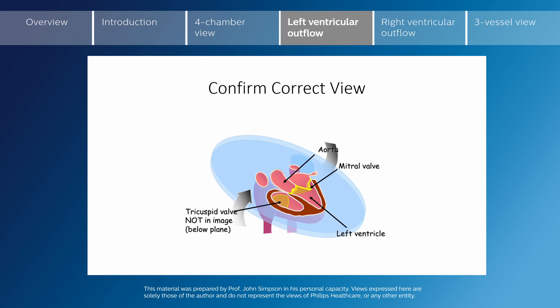We can see that we have now left the tricuspid valve below the plane of inclination, so we do not see it when we look at the left ventricular outflow tract. What we would like to see is the left ventricle connecting to the aorta, which heads superiorly and to the right towards the fetus's right shoulder. We can also see that we are now beginning to move above the level of the right atrium and starting to cut the superior vena cava in transverse section.